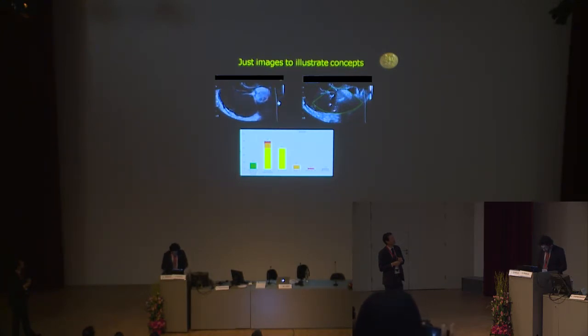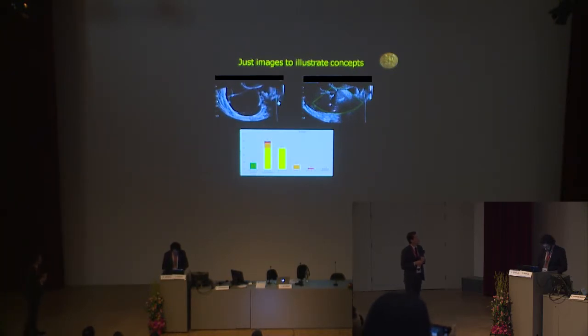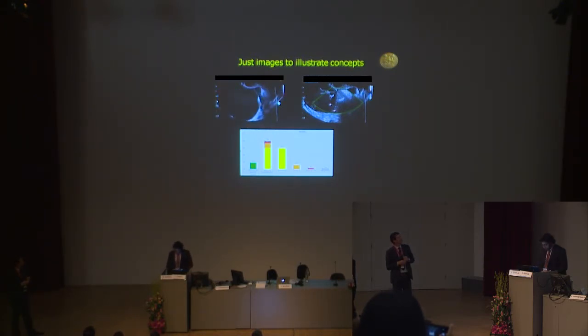Antonio, what do you think about this? High risk of malignancy. I thought about that being a shadow, but I think it's a reverberation. That might look similar, but it is different.